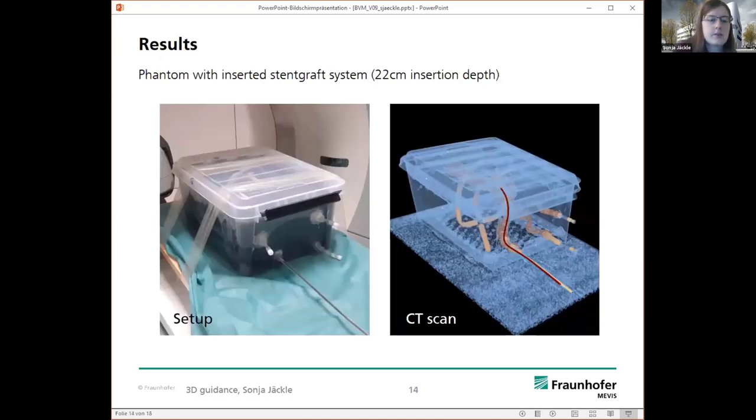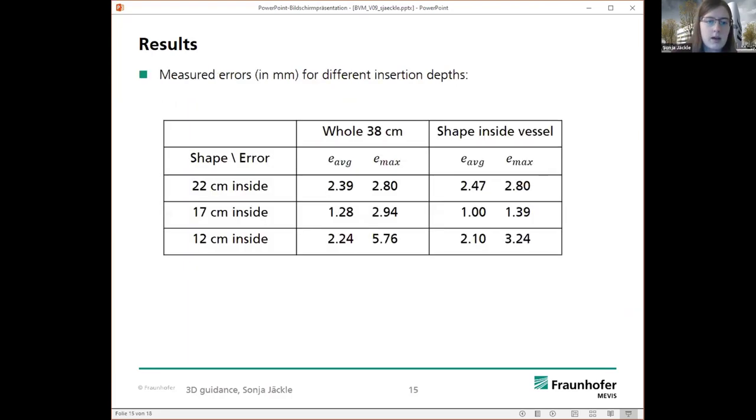So, how does it look like? On the left side, we can see the setup where we have inserted our stent graft system approximately 22 centimeters. And on the right side, we see the corresponding CT scan, and then we can observe that the shape obtained with our guidance approach here in red is looking very good. It's near the ground truth, you can see here, and it looks really promising. So, but what's about the accuracy, the errors?